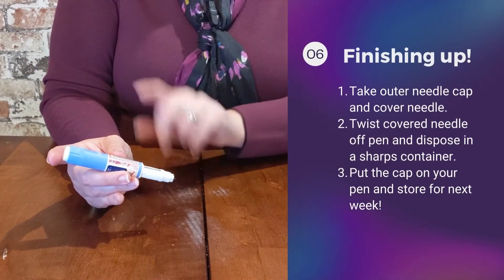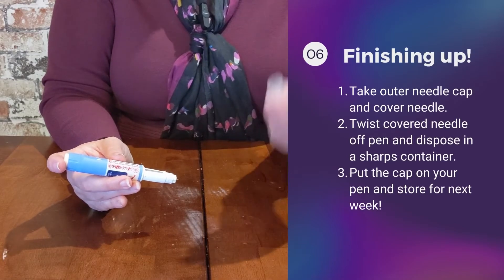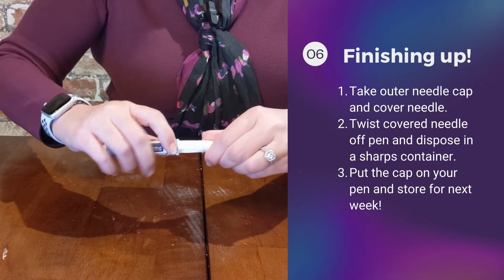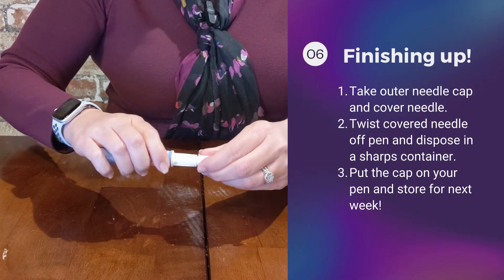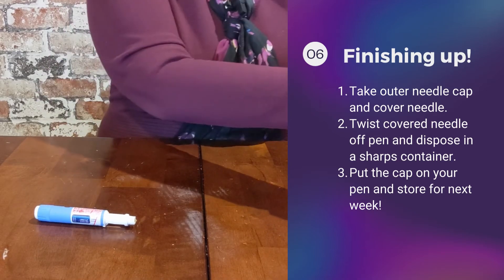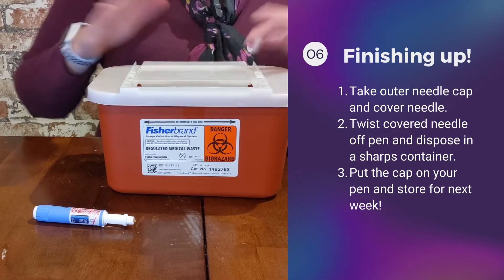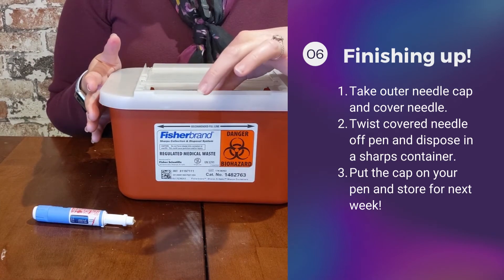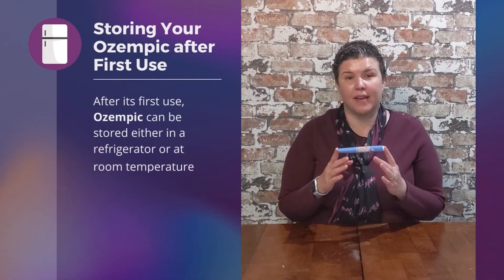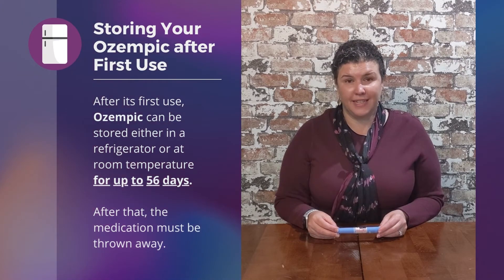Then we need to remove the pen needle. Take the cap that I told you to save and, twisting in the opposite direction, remove the needle. You should have a sharps container from your local pharmacy — drop the needle into the sharps container. For Ozempic, the pen can be stored at room temperature for up to 56 days. If you have medication left in the pen after that, it must be thrown away.